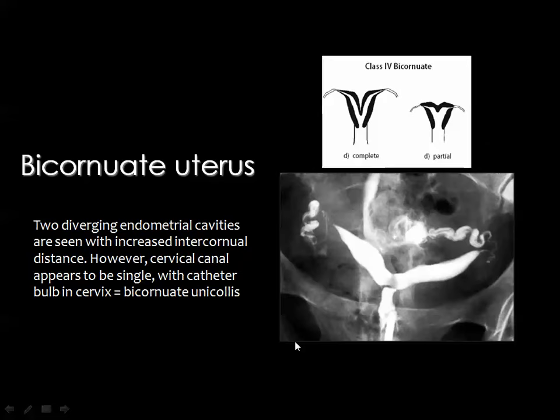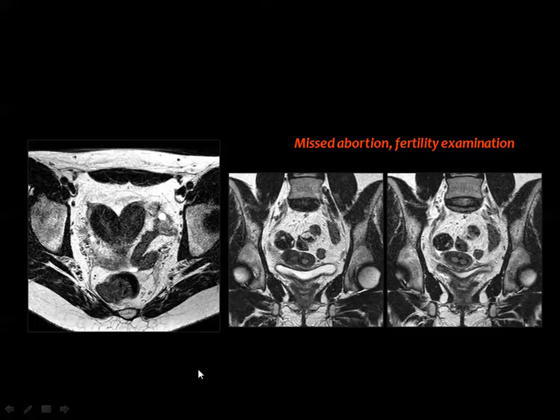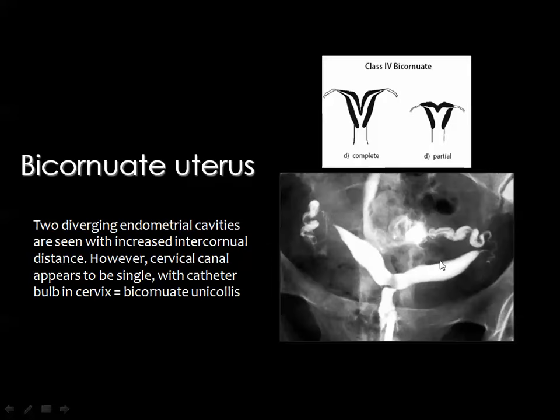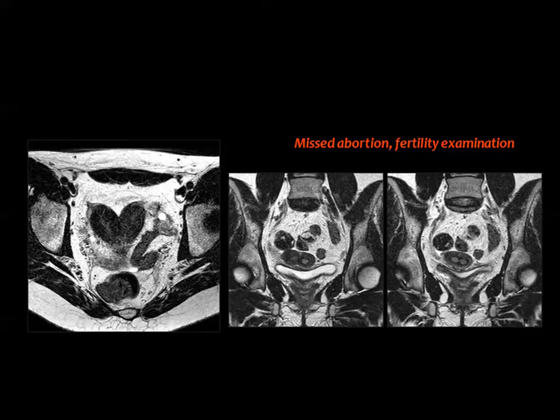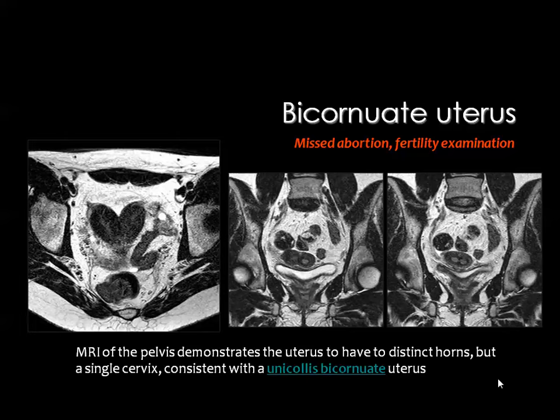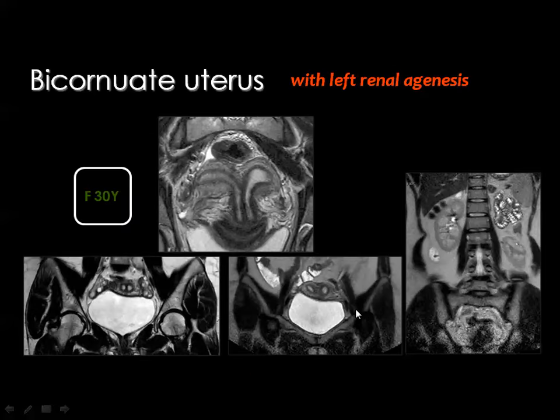In bicornuate unicollis uterus, a single cannula introduced into the single cervical canal opacifies both uterine bodies. Another example shows some fusion between the bodies of the uterus with two separate cervical canals visible, consistent with bicornuate bicollis uterus. Renal anomalies may coexist, such as a single kidney showing compensatory hypertrophy due to absence of the contralateral kidney.